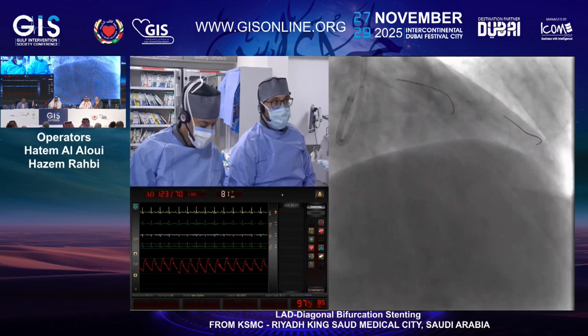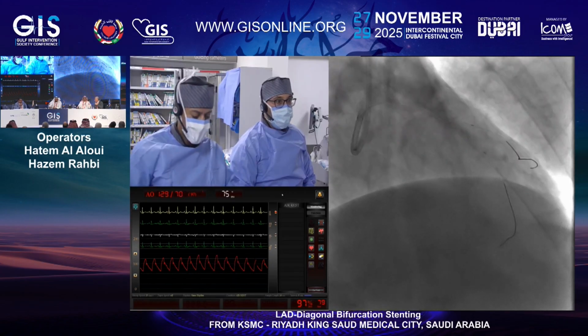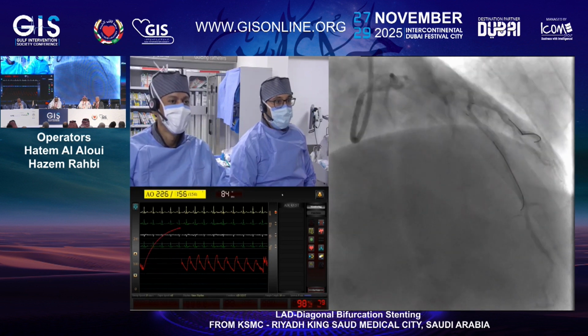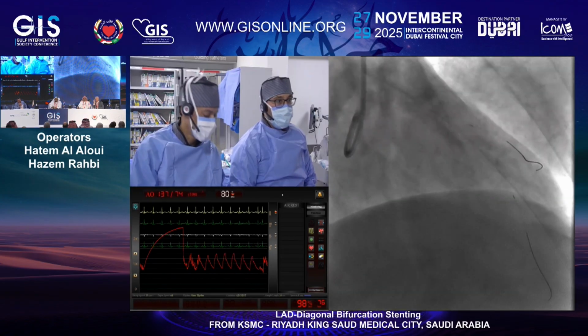That's my question. Dr. Abdullah Shahab is one of the Gulf experts in DCB here, and is also favoring DCB. So the question here: why would you use a stent in this big vessel and not do only DCB?